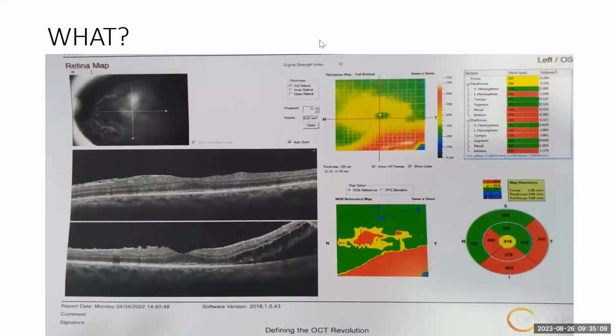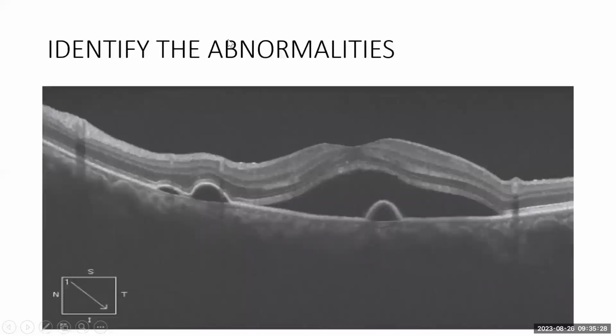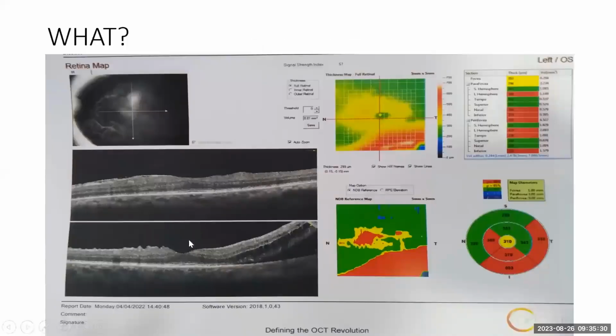Okay, there's a chart. Let me see. Here, neurosensory retinal detachment in the inferior hemiretina. Dr. Idris, I didn't ask you. Okay, so. Good morning, sir. Good morning. Go ahead, Dr. Sukoya. So I just want to give it a trial, sir.